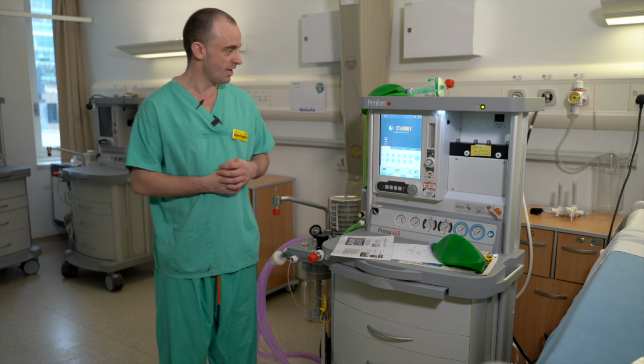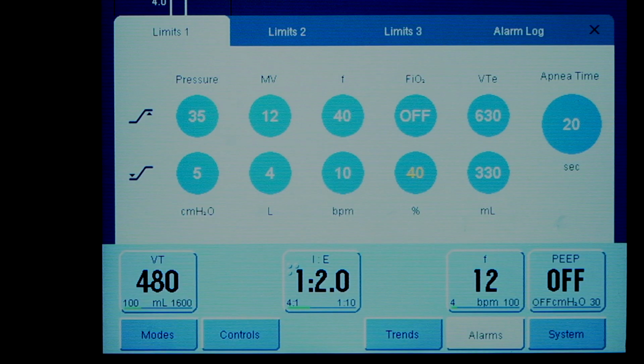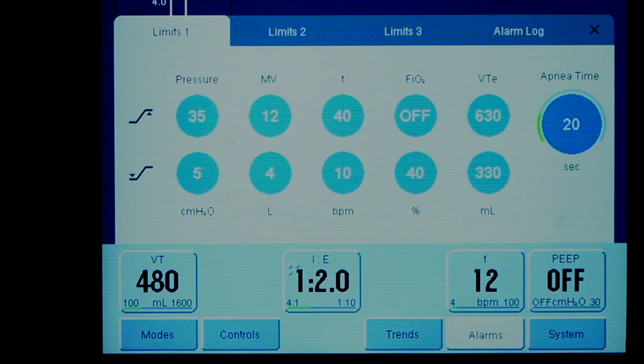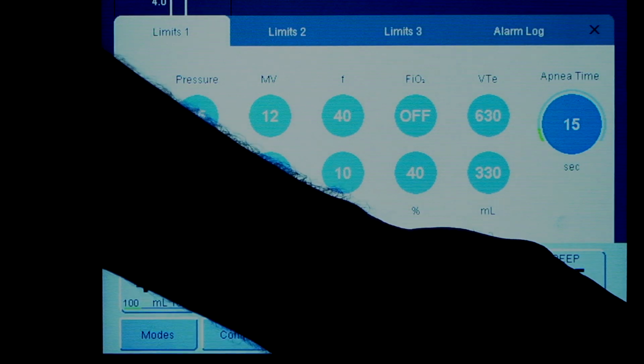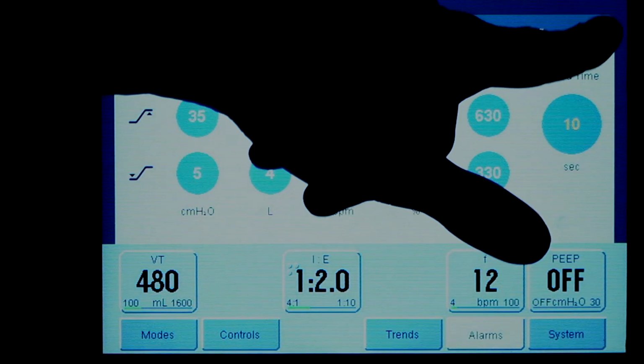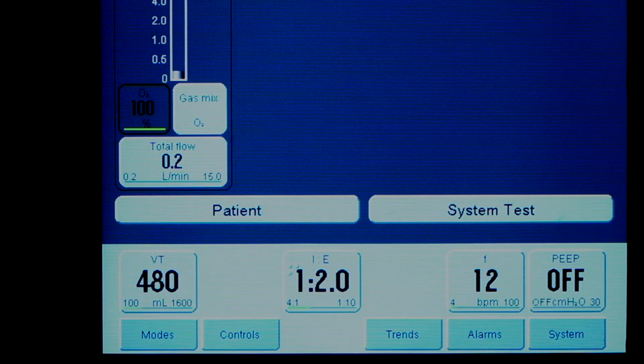Last thing is the tidal volume, and again, this is set largely by your baseline demographics, and actually they're pretty reasonable. But the last thing is the apnea time, which defaults to 20 seconds. Again, we prefer a shorter value in intensive care, so recommend that this is changed to 10. Having set all our alarms, we can press the cross button, and this will take us back to the main screen where we can set up our modes of ventilation.